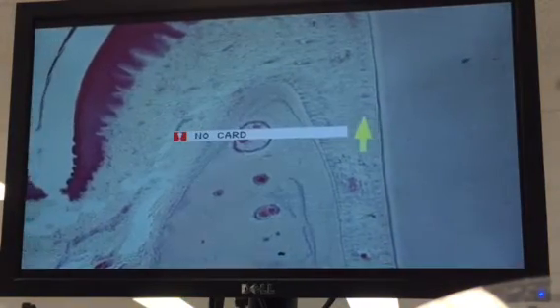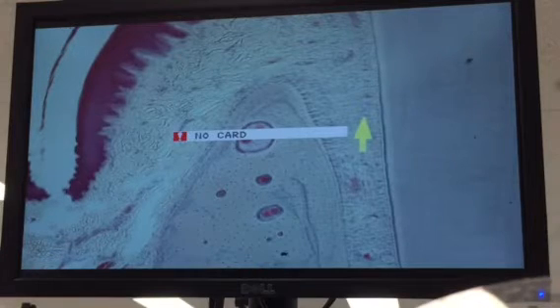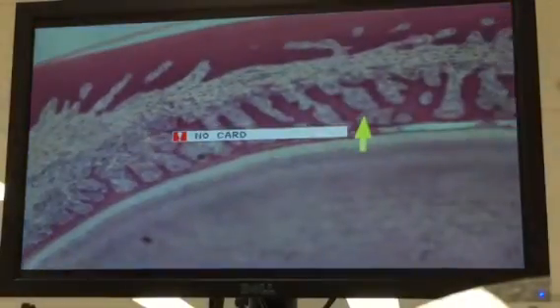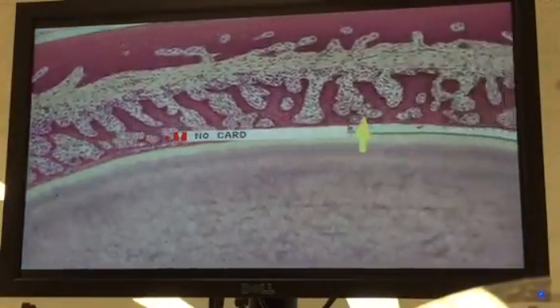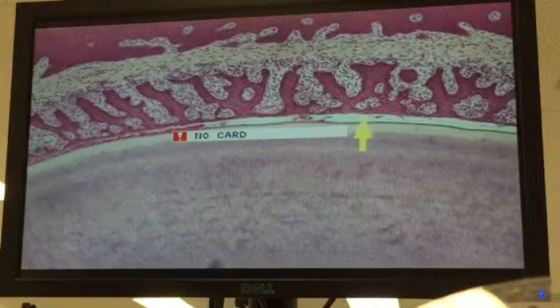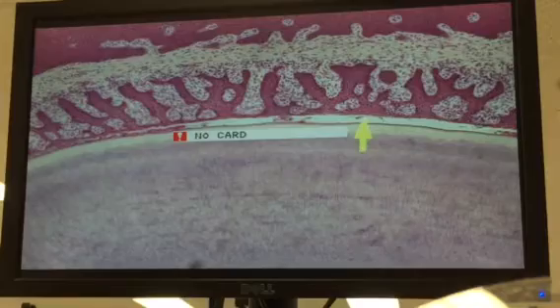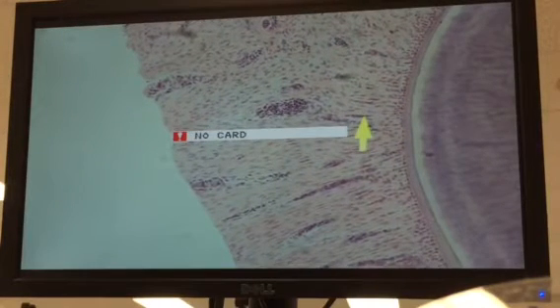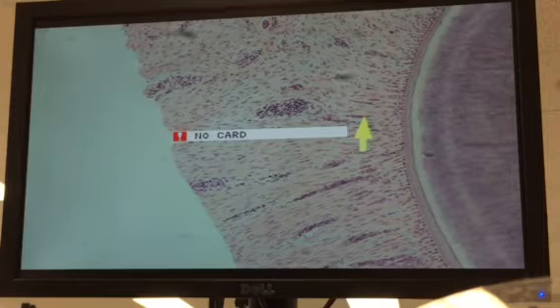Okay, well the only thing we're missing in here would be the transeptal fibers and also the epithelial rest. Now there is that cross section through the tooth, and you need to be a little bit careful when you look at this, because up here, that's the enamel space. This would be the attached gingiva in here, or the junctional epithelium. But in some of these, you'll have a profile in which you have some cementum, a layer of osteoblasts, and right there is an epithelial rest. And you can see that on some of the other slides as well.